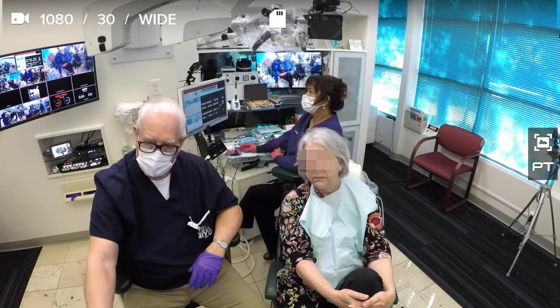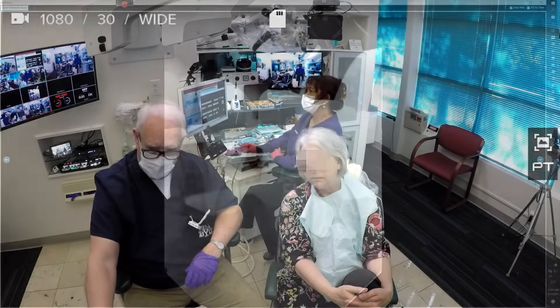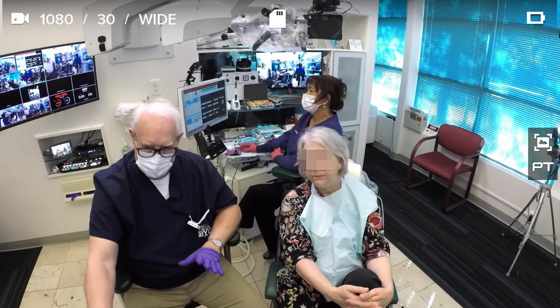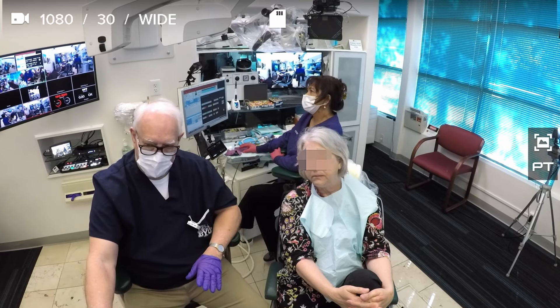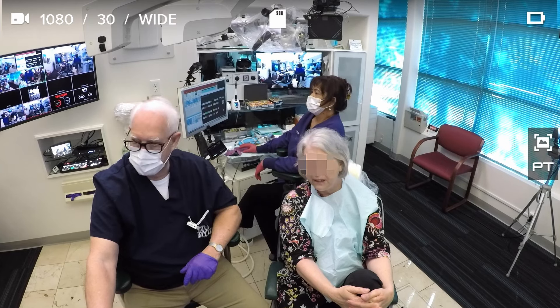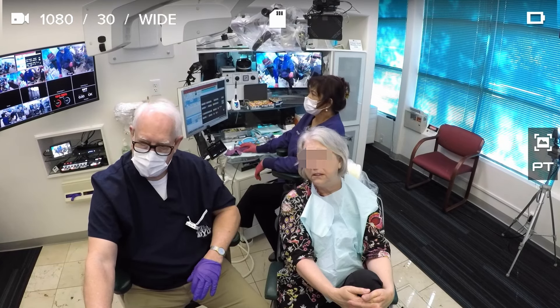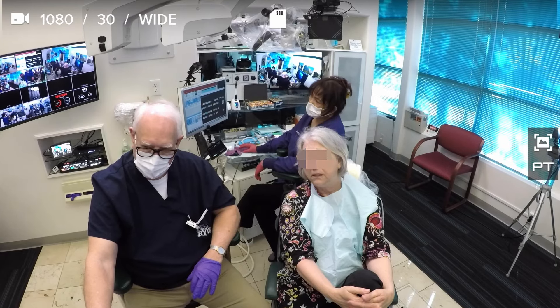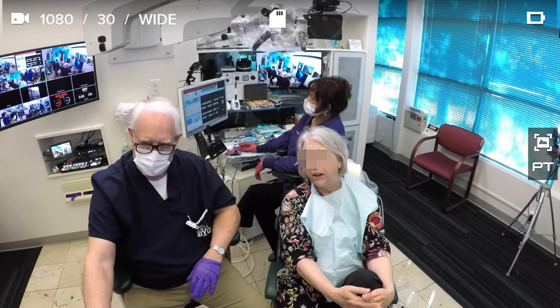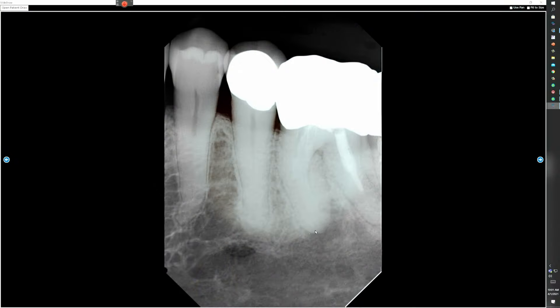That's when we take the file. I want to know that this is exactly where I want to be. I don't want to poke through because then I'm worried about the next visit. I was nearly there — I'm exactly where I want to be. And then the calcium hydroxide that we put in, I don't want that to go way down into this lesion. So the first calcium hydroxide visit, I just get it in there, and then when we finish the prep down here, I'll get calcium hydroxide all the way in.